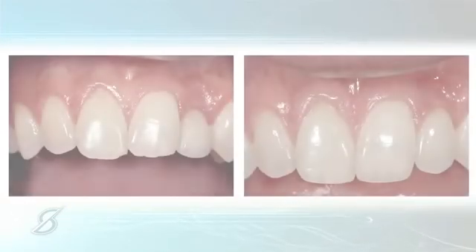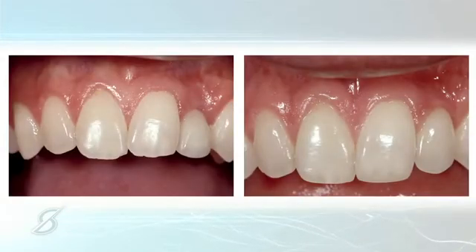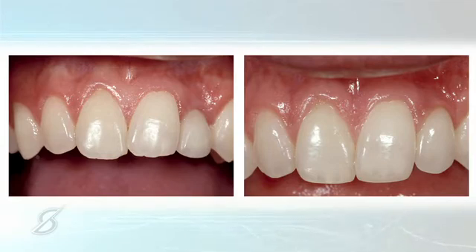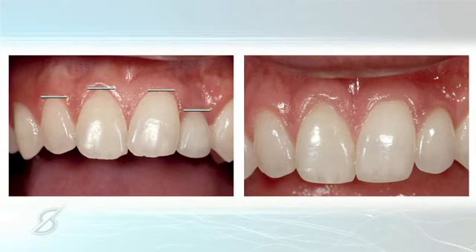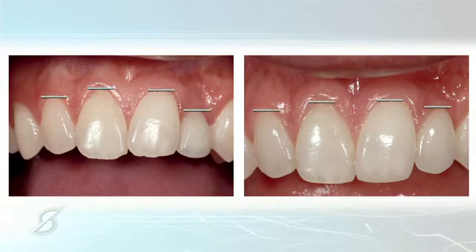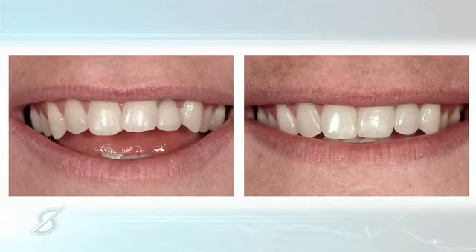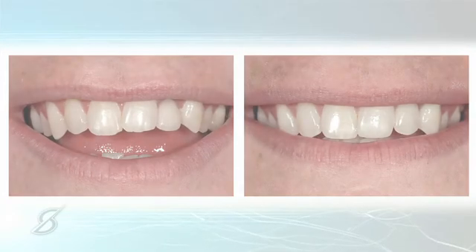And here you can see we've also done some composite restorations on the incisal edges of both centrals to make them more attractive and more even. But if you look now, the crown length of the two lateral incisors is essentially equal. And when we also compare the smile, you can see the improvement with the composites on the centrals and just the incisal edge form of the new left lateral incisor. So those are two examples of using molding to move tissue.